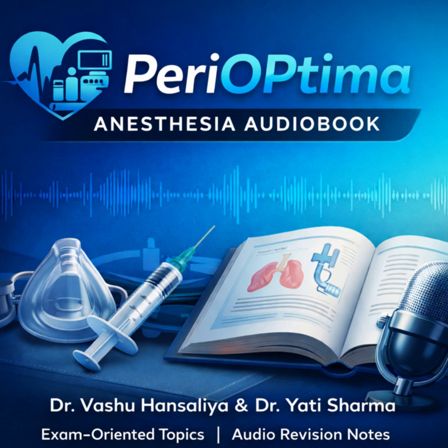Right. The HME is basically an artificial nose. You place it close to the patient's airway. How does it work? On exhalation, it captures heat and moisture from the patient's own breath. Then on the next inspiration, the fresh, dry gas flows through it and picks up that stored heat and moisture. It's recycling the patient's own resources. That's a great way to put it.